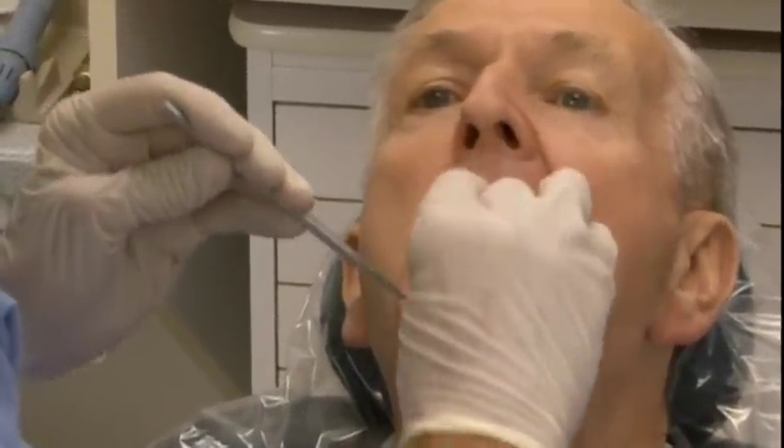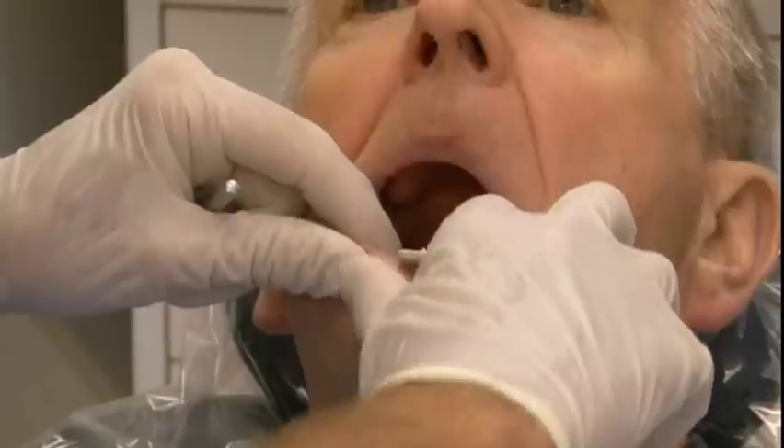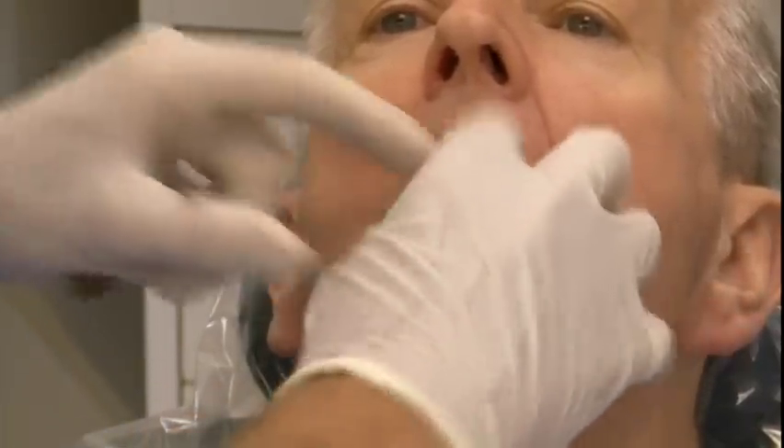Starting with the lower tray first — I've got wax all the way around. I'm going to roll it in there. Lift your tongue up — perfect, kind of stick it out at me and relax. I can take a look to see how much room I've got and whether I've gone too far down his throat. It almost sits in there without me holding it — I've got a little suction even. So we feel pretty good about that.